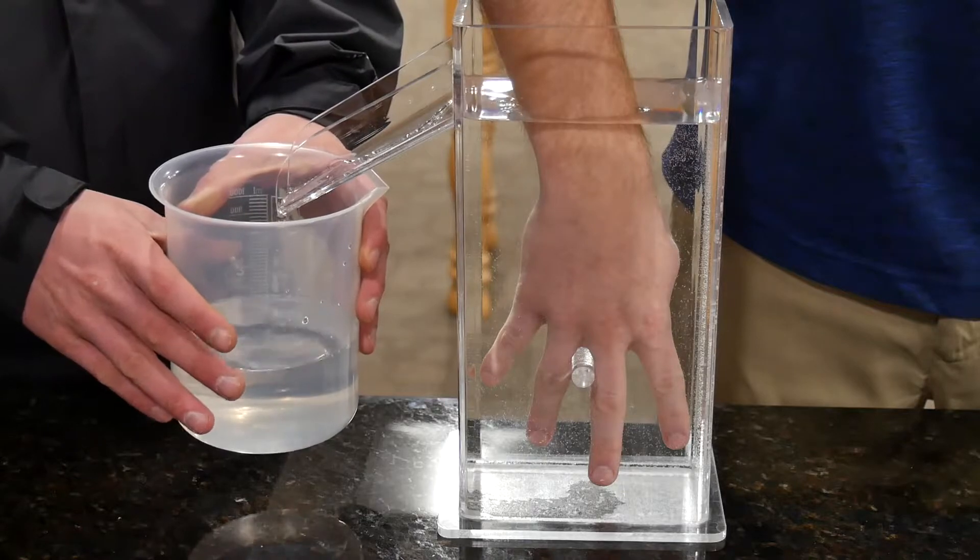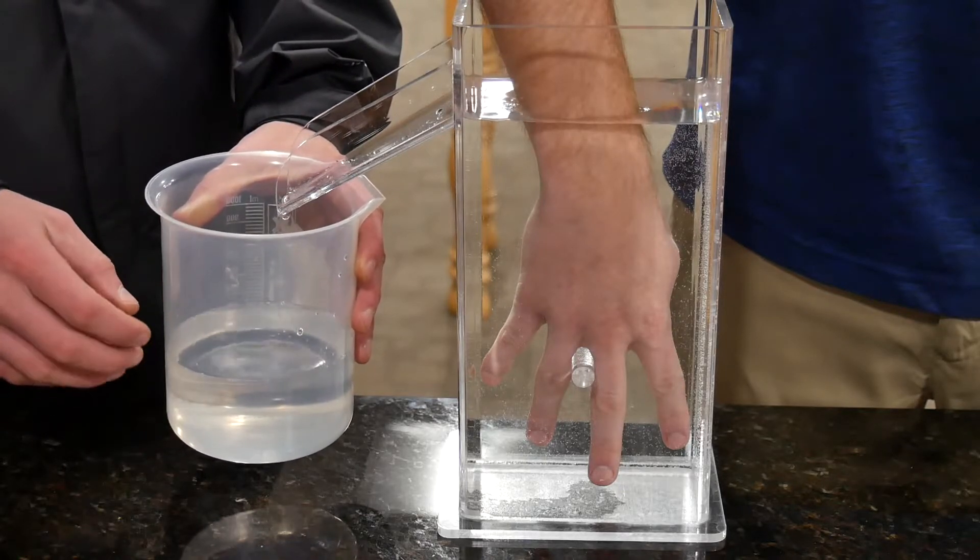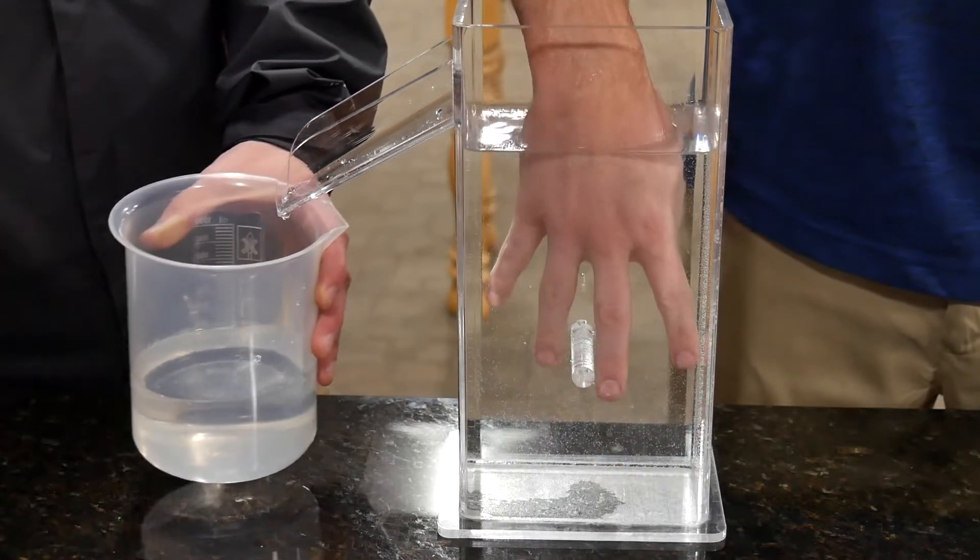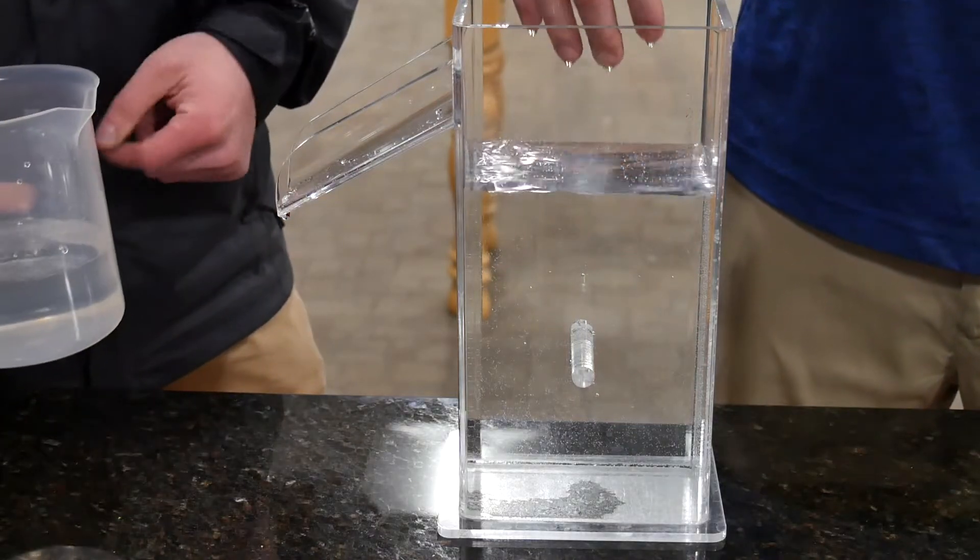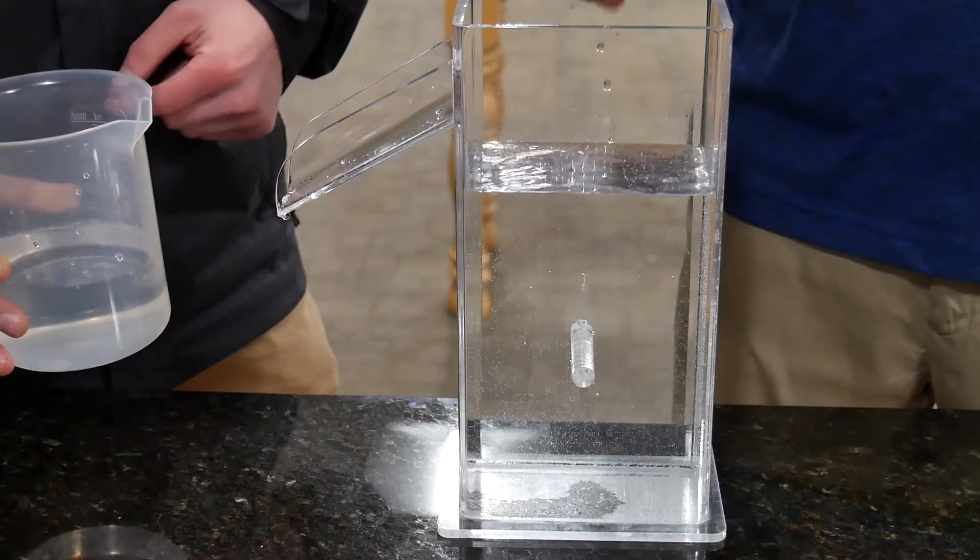And guys, once the water has stopped running and the patient can pull their hand out, you can go ahead and let them know they can pull their hand out and dry it off while you measure the water in the cylinder, which we'll do next.